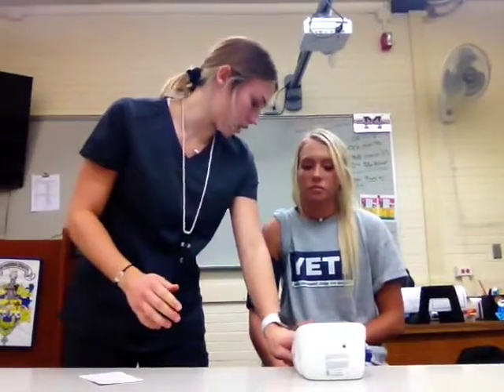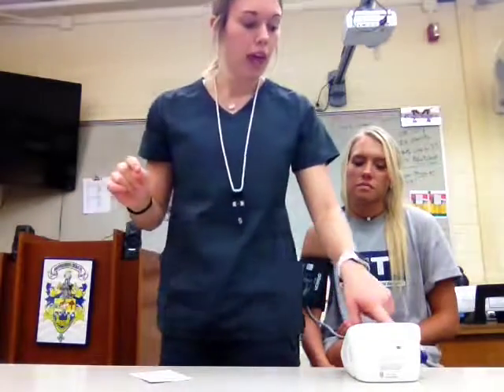On a manual cuff, you want to inflate the cuff to 180 millimeters of mercury. Once you have obtained 180 millimeters of mercury, you want to slowly deflate the cuff at a rate of 3 millimeters of mercury. Once you start deflating the cuff, you are wanting to hear for the first beat. This is known as the systolic pressure. As you keep deflating the cuff, you want to now listen for the second beat, which is known as the diastolic pressure. Once you have completely deflated the cuff, this is your full blood pressure reading.